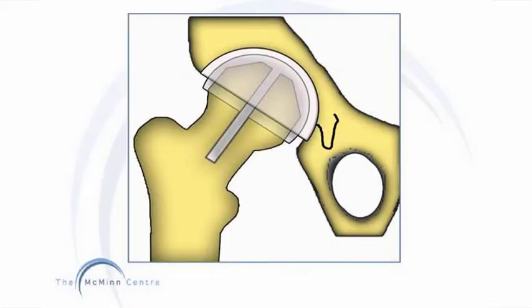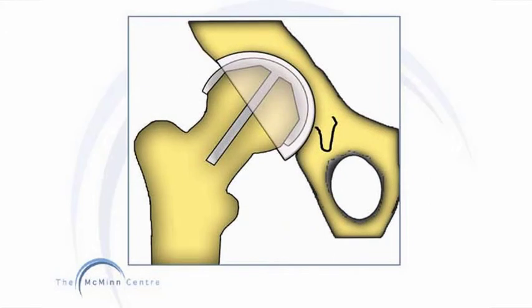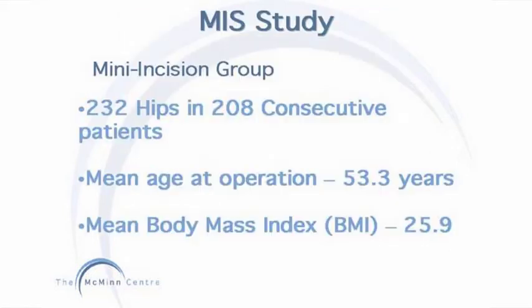The acetabular cup positioning is also very important, and there is only a small margin of error. If the cup angle is too small, the cup is closed and it could lead to impingement of the neck, and there is also the risk of it becoming loose and failing. If the cup angle is too high, the cup is open and there is the potential for edge wear, which reduces its survival.